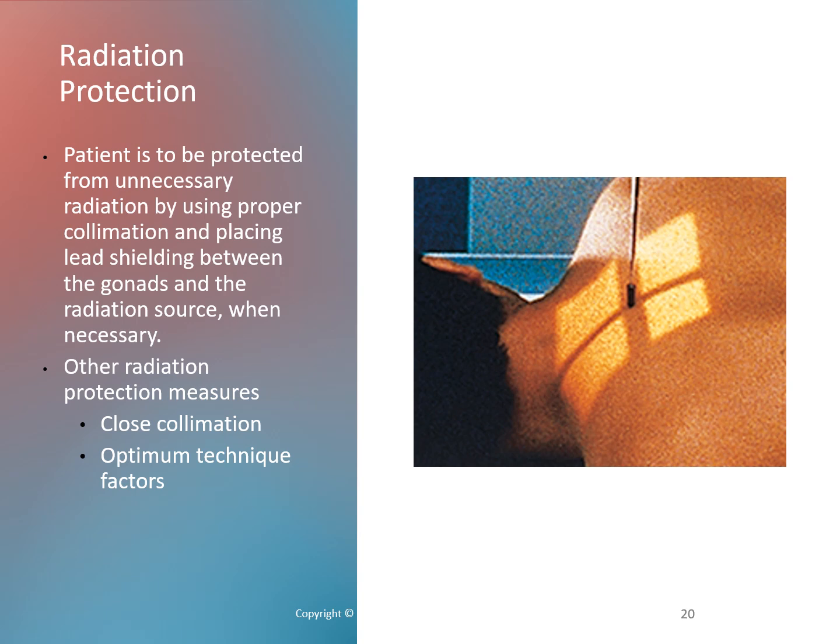Using close collimation controls scatter, so it controls your subject contrast, that is your raw data contrast, and makes it more likely that the image will be diagnostic and displaying with proper contrast and brightness. Okay. Use an appropriate kilovoltage to ensure adequate penetration of the part, and the kilovoltage should be proportional to part thickness, regardless of what body part or projection you are attempting.